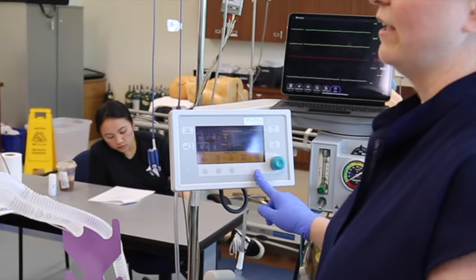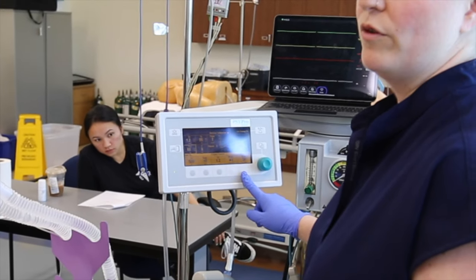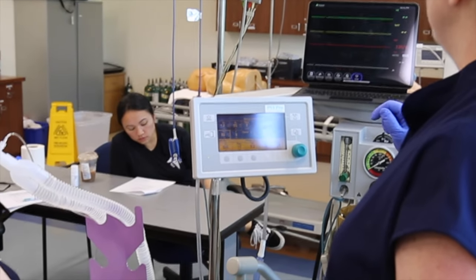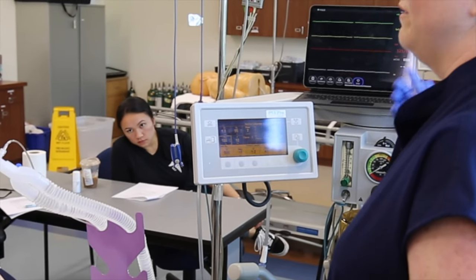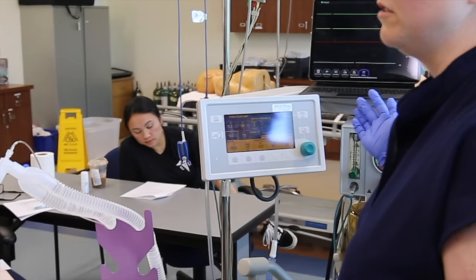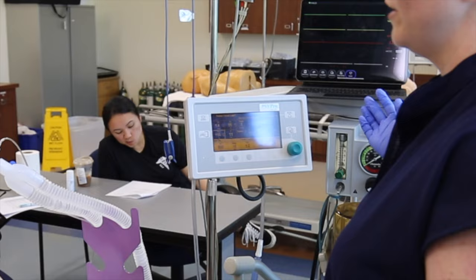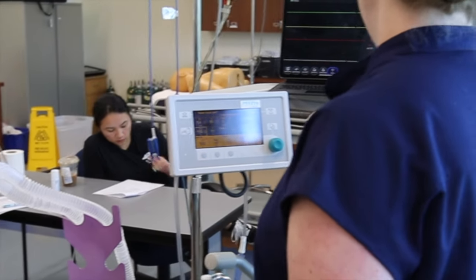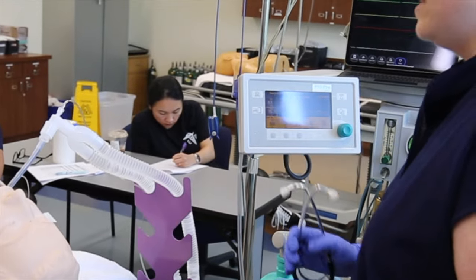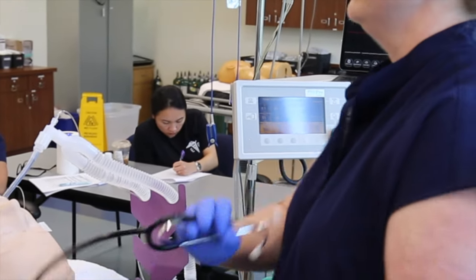I'm in vent mode. I'm assessing the ventilator to make sure I'm getting adequate tidal volumes and looking at waveforms, peak pressures. And I'm also looking at the monitor to check blood pressure. We just did give a pretty walloping dose of propofol. Healthy 20-year-olds is generally not a problem, but plenty of other patients do not tolerate that as well. So you're just going to assess all of those things and make little tweaks as necessary, or maybe push some phenylephrine if your intubation did not correct your induction hypotension.